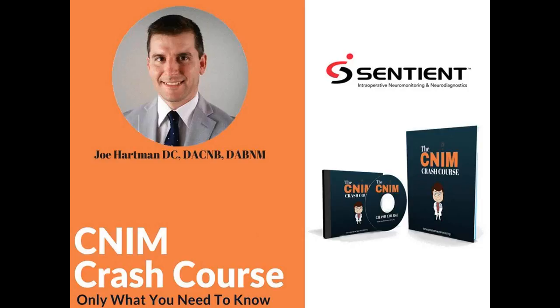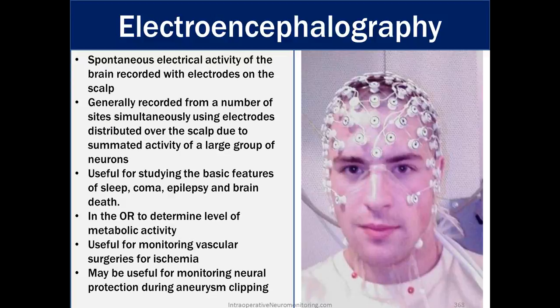This one's going to cover EEG monitoring. So electroencephalography is the spontaneous electrical activity of the brain recorded with electrodes on the scalp, generally recorded from a number of sites simultaneously using electrodes distributed over the scalp, due to summated activity of a large group of neurons. It is usually used for studying the basic features of sleep, coma, epilepsy, and brain death. In the operating room, it determines the level of metabolic activity of the brain. It's useful for monitoring vascular surgeries for ischemia, and it may be useful for monitoring neural protection during aneurysm clipping. See that I did not put depth of anesthesia on there.